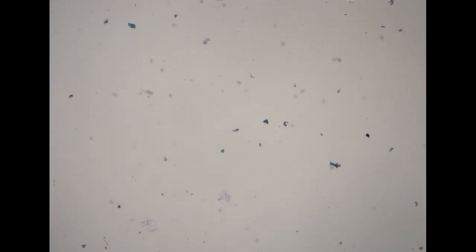So on this low power feature, you may think, could it be a follicular neoplasm? Because it seems to be scattered, very small and tight clusters, looking a little bit like a microfollicular pattern. So on low power, we have this impression that this is likely a tumor and likely a follicular neoplasm.